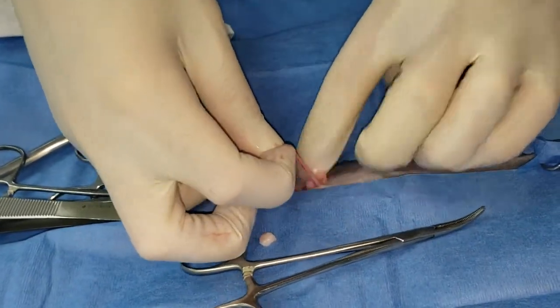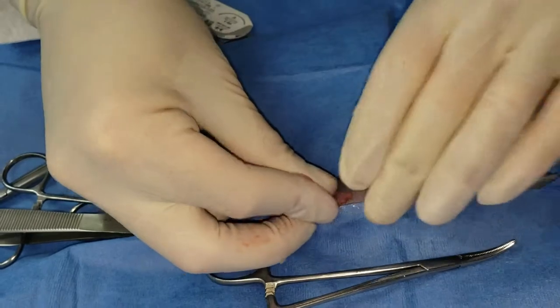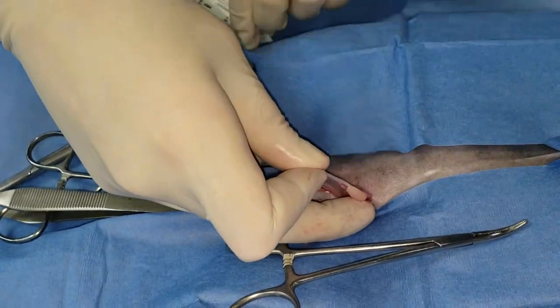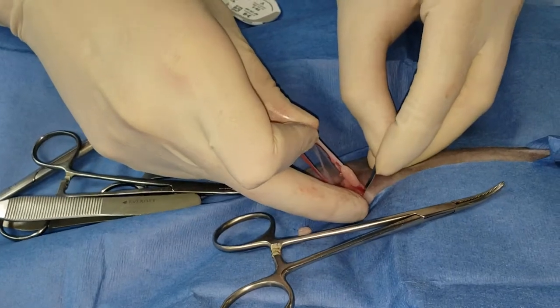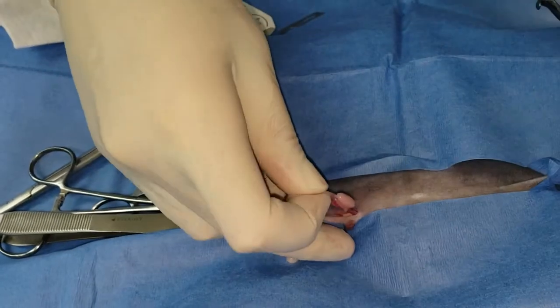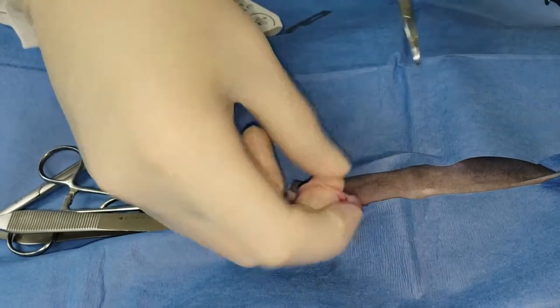Now you can see everything a lot better. Obviously this is a pediatric spay — these vessels are tiny. I could rip this and it wouldn't bleed, but I've got to do everything right. Cut the suspensory, push down the body wall, and it's released. Then hemostats through to make my window, and then another pedicle tie.